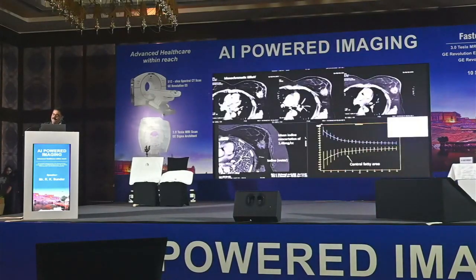A female patient who came with abdominal pain, and she had a breast lump detected clinically. We have done spectral imaging. Of course, breast imaging is not yet established as a strong modality with CT, but we have done a breast scan along with the abdomen.